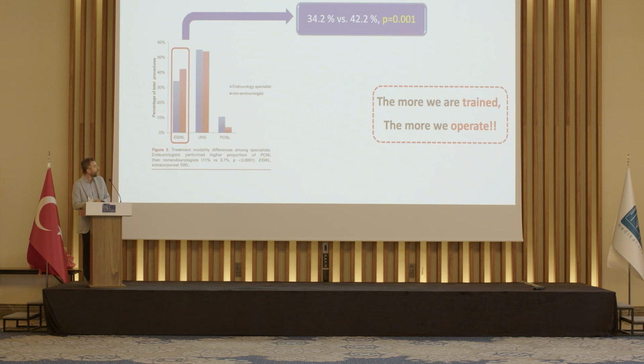When they are compared for selecting between shockwave or flexible ureteroscopy, the endourology trained ones select flexible ureteroscopy and endourology procedures more, and the ones that are not endourology fellowship trained select shockwave lithotripsy more. So the more we get trained, the more we like to operate.